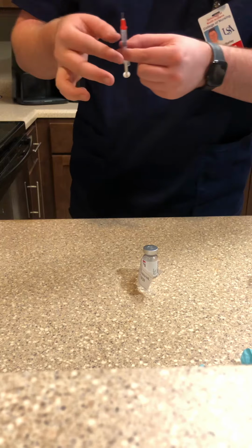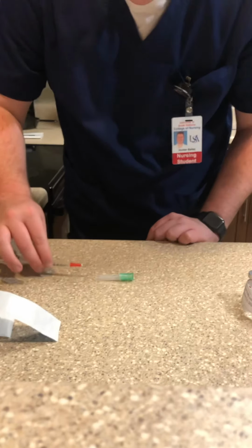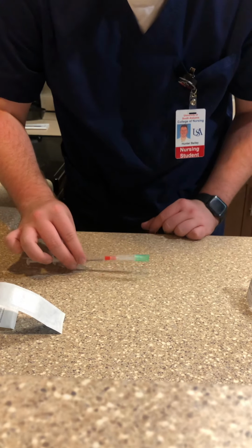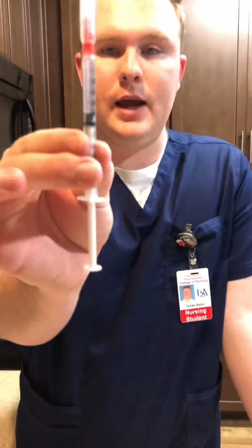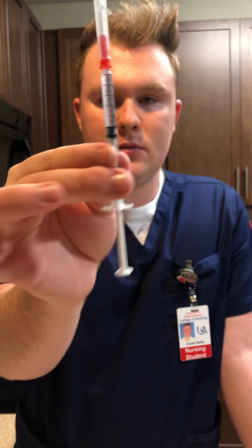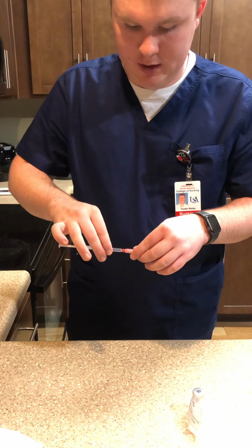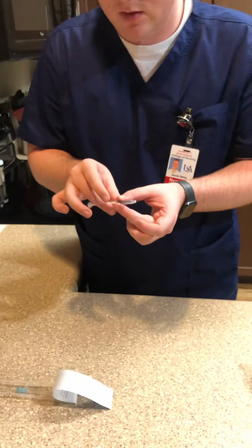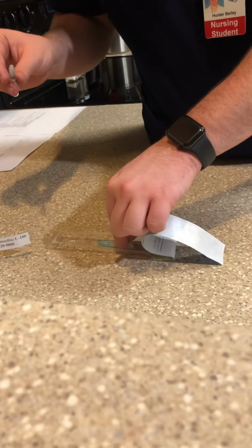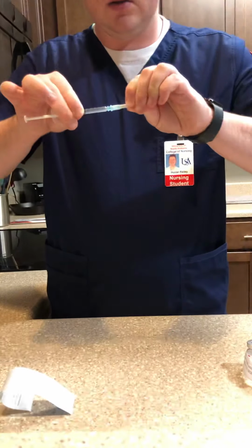Now what I'm going to do is scoop the blunt tip cannula, and I want to show that I have exactly half a milliliter. I am going to take this off and dispose of this in the sharps container. Now I'm going to take my needle and connect.